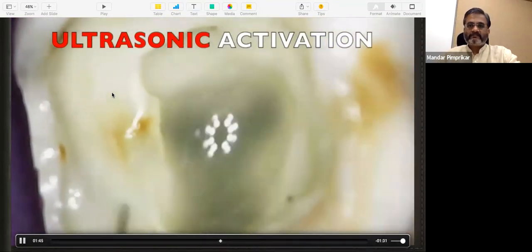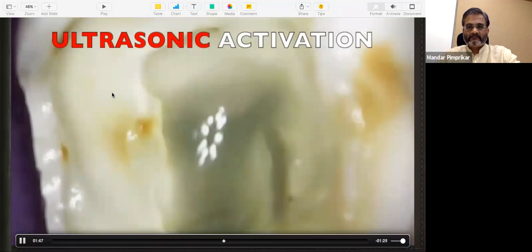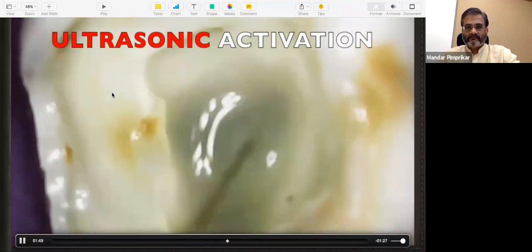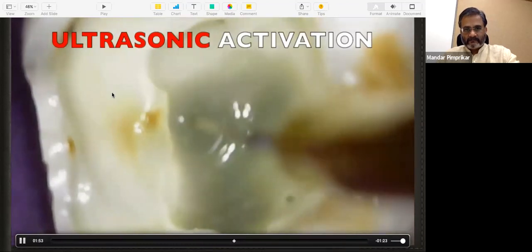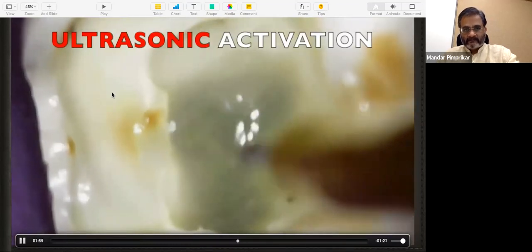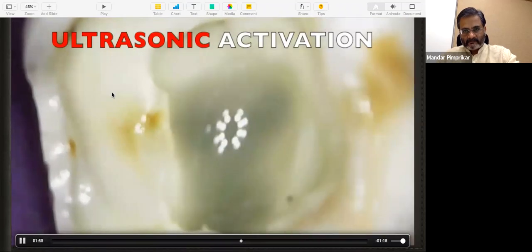And most importantly, if you can notice in this video, the moment the tip contacts the canal walls, the cavitations are lost. So although it is a very effective way of activation, ultrasonic comes with a lot of limitations.